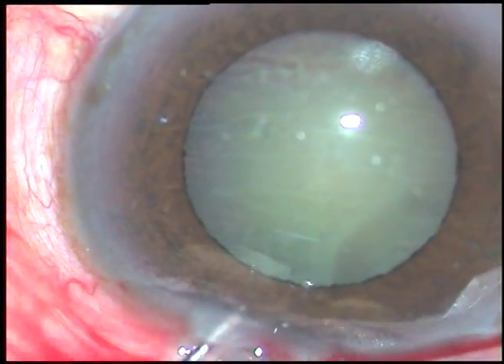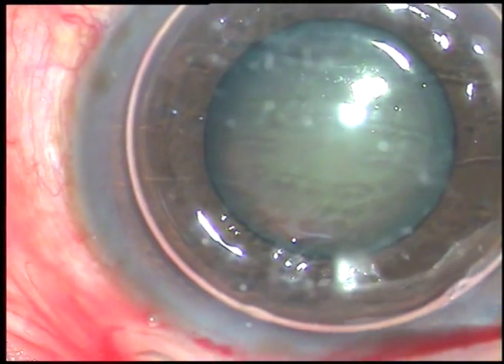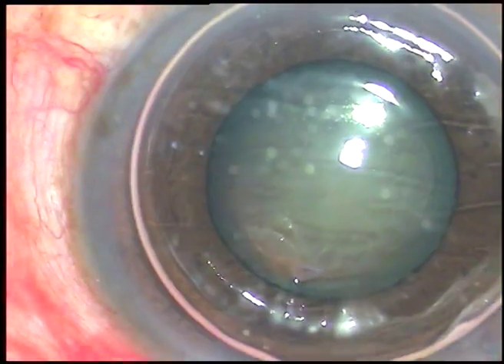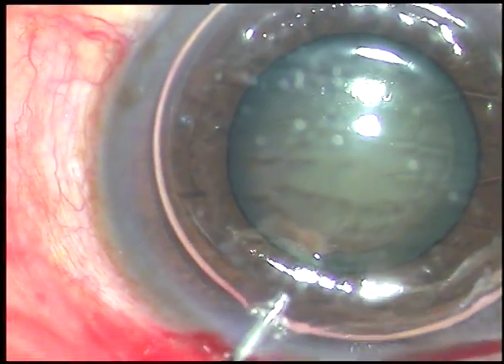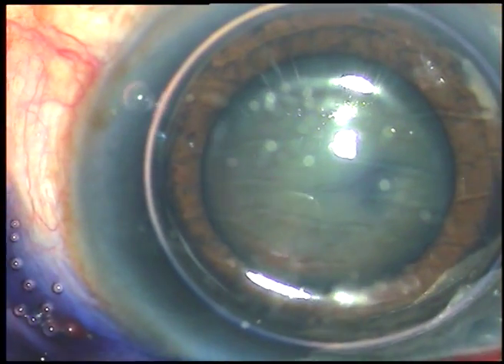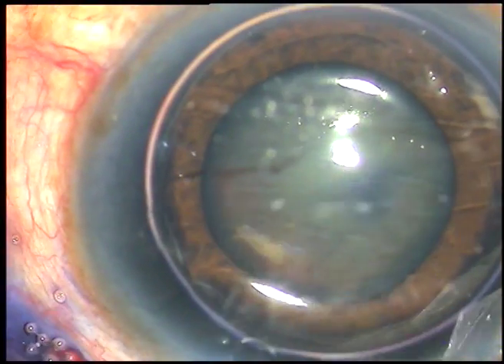This is an air bubble. The idea is to stain the anterior capsule with trypan blue dye, and here goes 0.06% trypan blue dye. The dye is washed out.